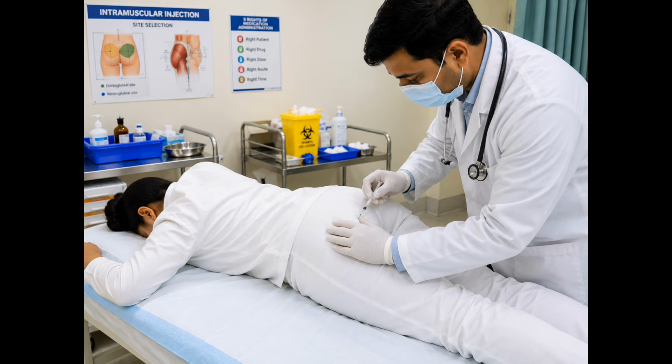Immediately after the injection, the needle and syringe are safely discarded into an approved sharps container without recapping. Proper disposal helps prevent accidental needle stick injuries and protects both healthcare workers and patients.